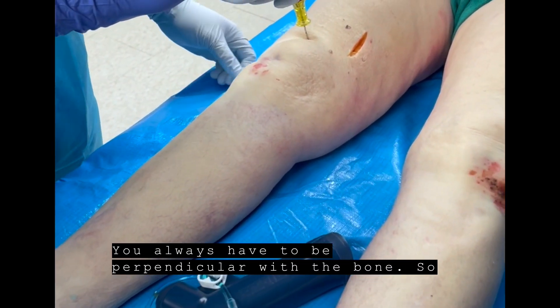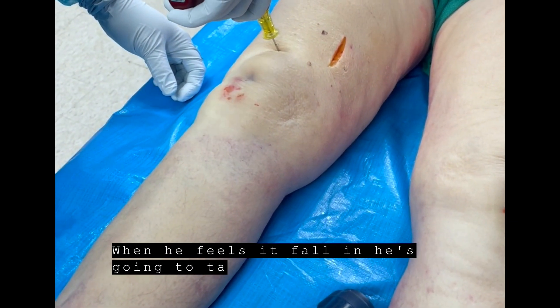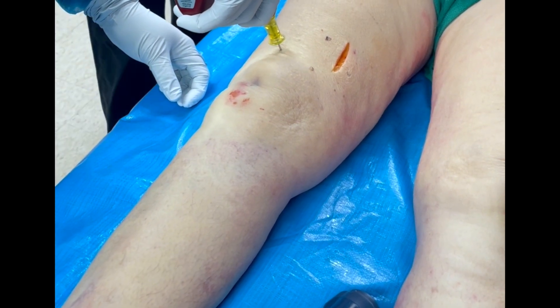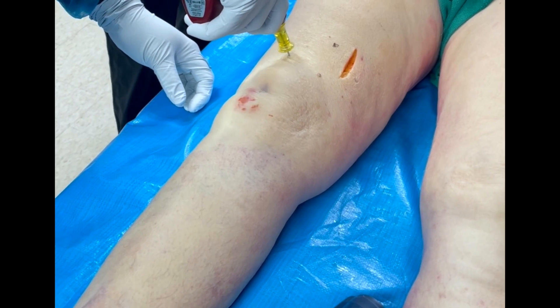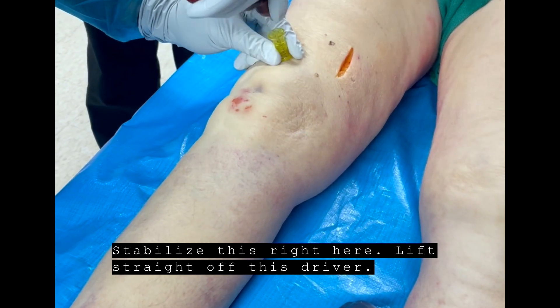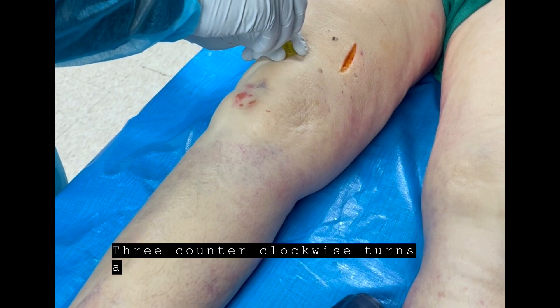So now you're perpendicular. All he's going to do is just squeeze the trigger, and when he feels it fall in, he's going to take his finger off the trigger. Go ahead. Beautifully done. Beautifully. Stabilize this right here and lift straight off that driver. Three counterclockwise turns, and that stylet comes out.